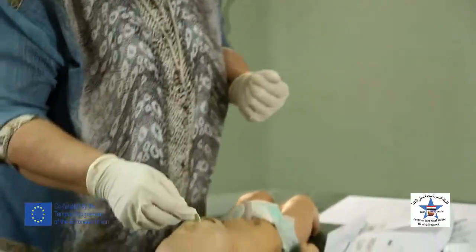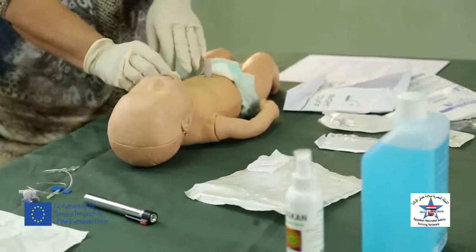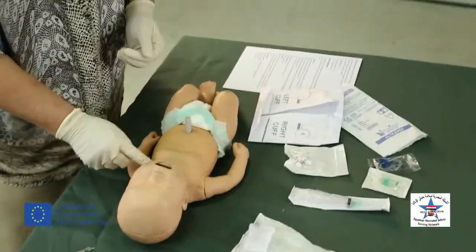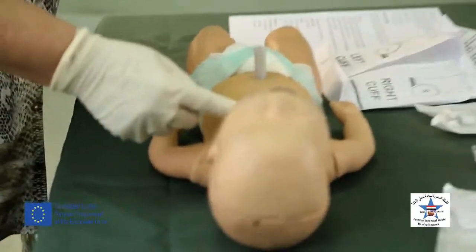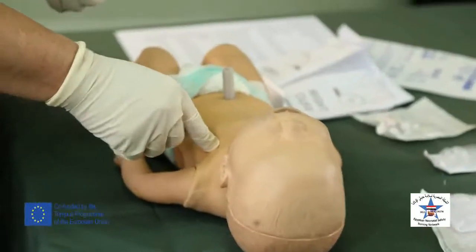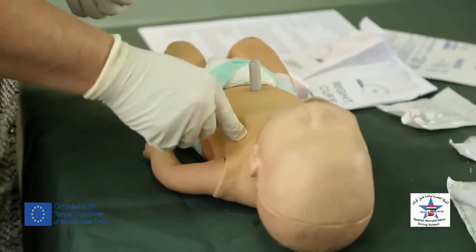I will sterilize the area of insertion with a simple alcohol swab, and then I will identify the site of insertion. The site of insertion is the mid-clavicular line. Here's the clavicle, and then I will go to the first intercostal space, second intercostal space in the mid-clavicular line. This is my site of insertion.